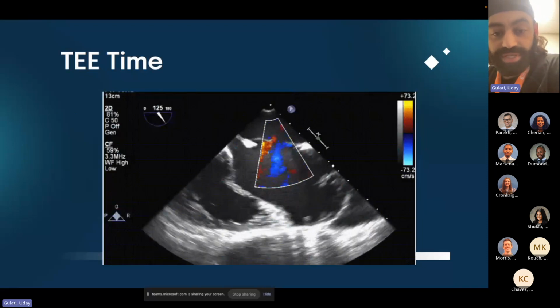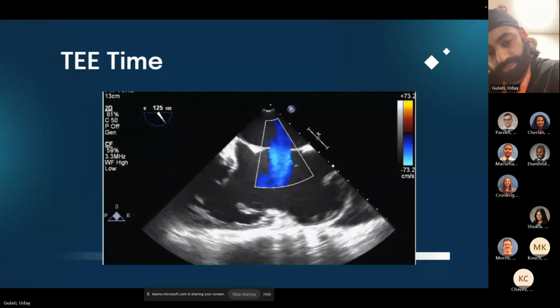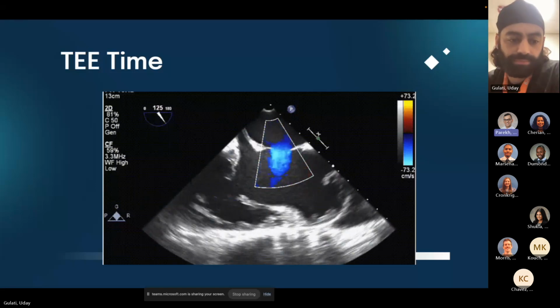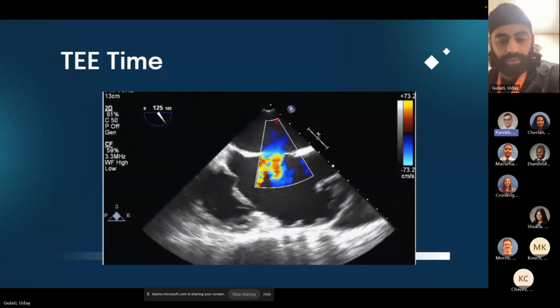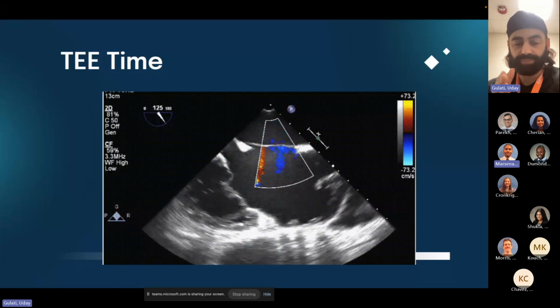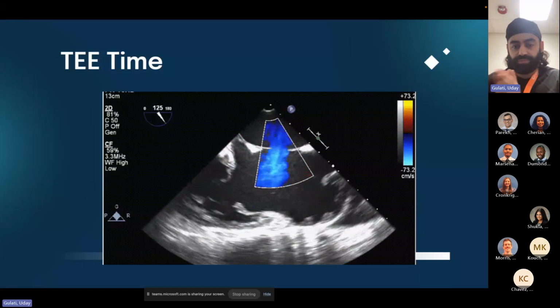All right, what's going on here? I'll give you guys a clue on this one, unless someone's able to tell me what view this is. It looks like, oh, actually, I was gonna guess left ventricle, but now I'm second guessing it. Is that the aortic outflow tract right there? No. So I'll give you a clue. This probe has been turned towards the right. So I'm going down this way, and I'm going like this towards my right side.